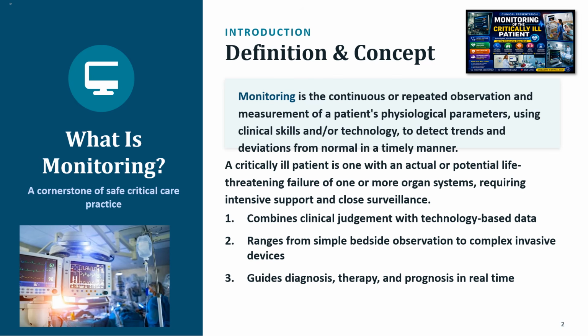1. Combines clinical judgment with technology-based data. This ensures accurate interpretation beyond machine values and supports sound clinical decisions. 2. Ranges from simple bedside observation to complex invasive devices. This allows monitoring to be tailored to the severity of illness and available resources. 3. Guides diagnosis, therapy, and prognosis in real time. This enables early intervention and better prediction of patient outcomes.